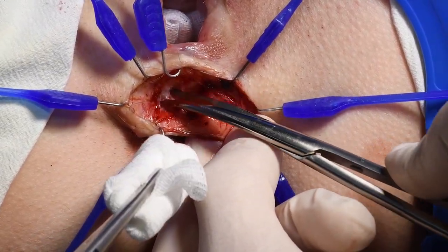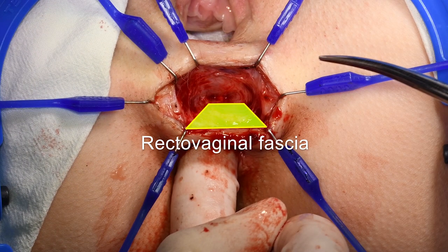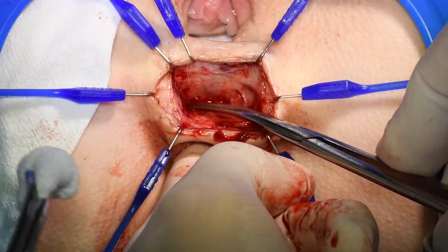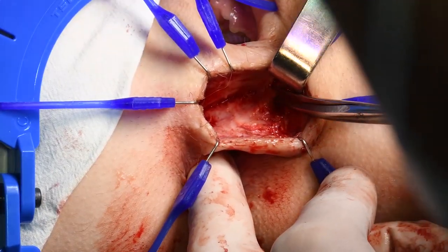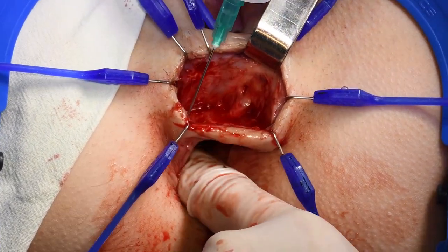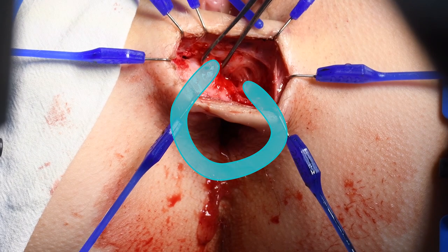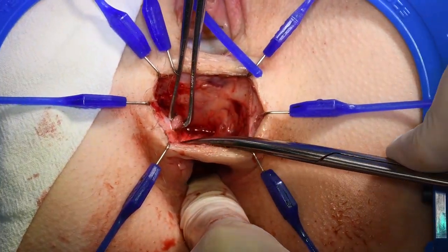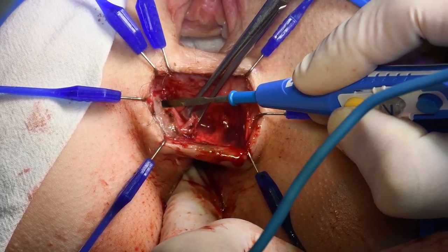Further dissection is performed by scissors or cold scalpel to prevent additional tissue damage. The edges of the torn sphincter are found and gently mobilized without cutting the scar tissue off. Great attention should be given not to damage the anoderm or vaginal mucosa.